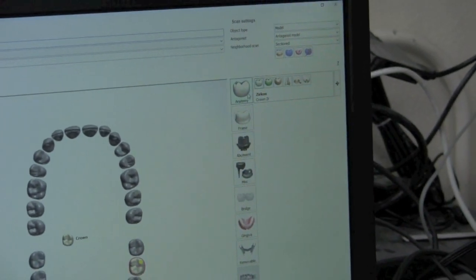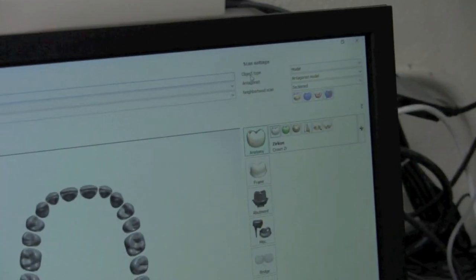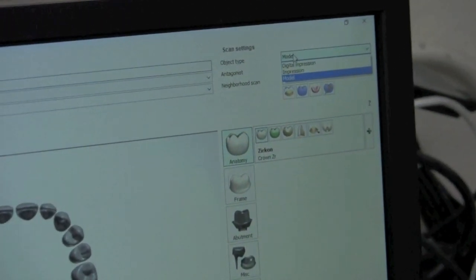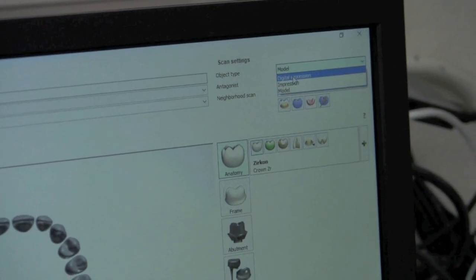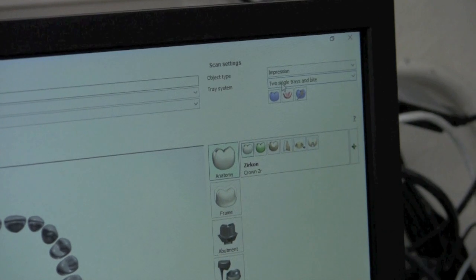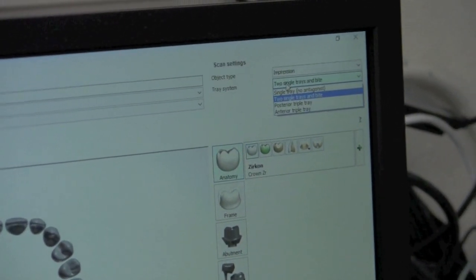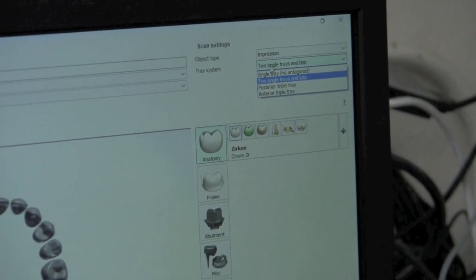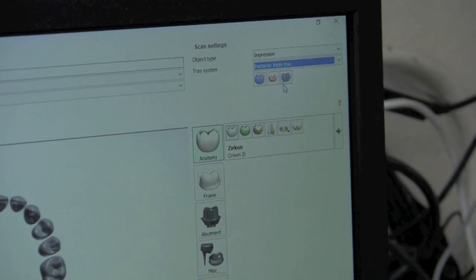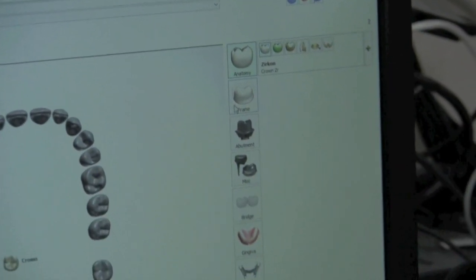Then I'll go up here to the top right and select Anatomy. Just above that we have a few options for scan settings. What we're going to want to change is the object type — we're going to select Impression instead of Model. And then under that you see Tray System. From there you're going to want to select what kind of tray you're doing. This is a posterior triple tray, so I'm going to select Posterior Triple Tray. And that's all you have to do for the setup.